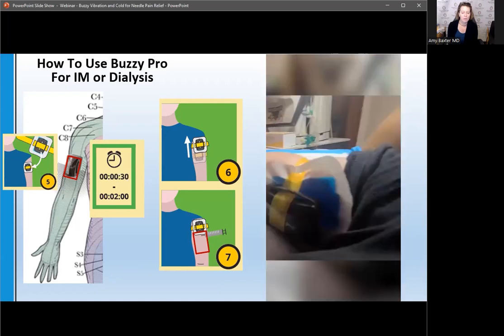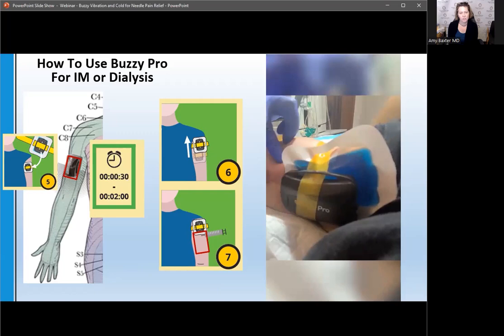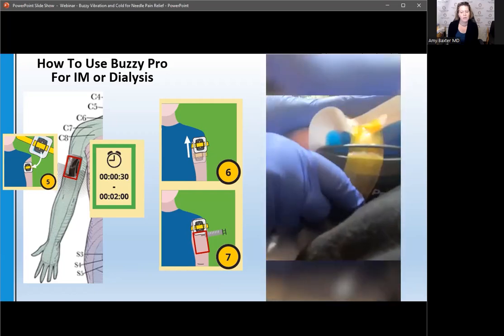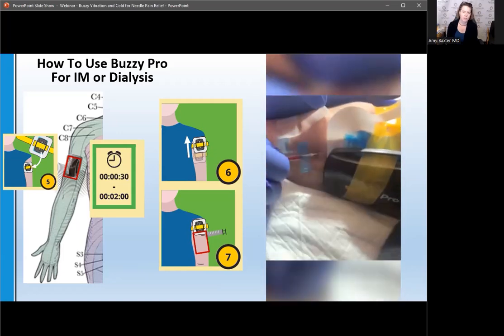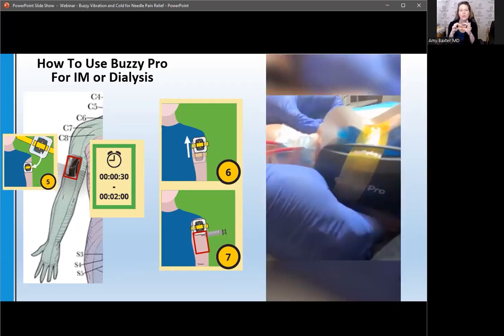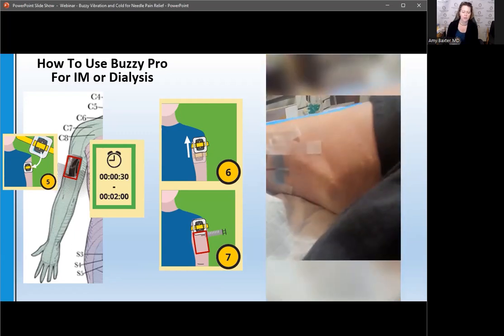They leave it on for about 2 minutes. They do the first one distal, but then the second one, they move it up so that they can do the second cannulation where Buzzy just was. And it's actually big enough that you could put the two right next to each other. So you can put both of the cannula right next to each other.